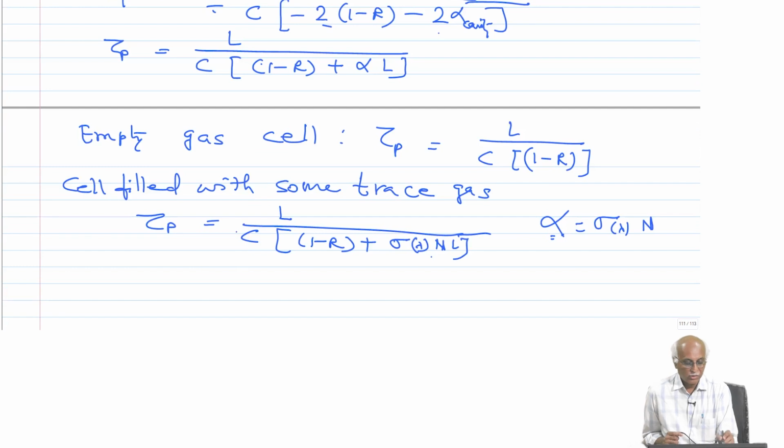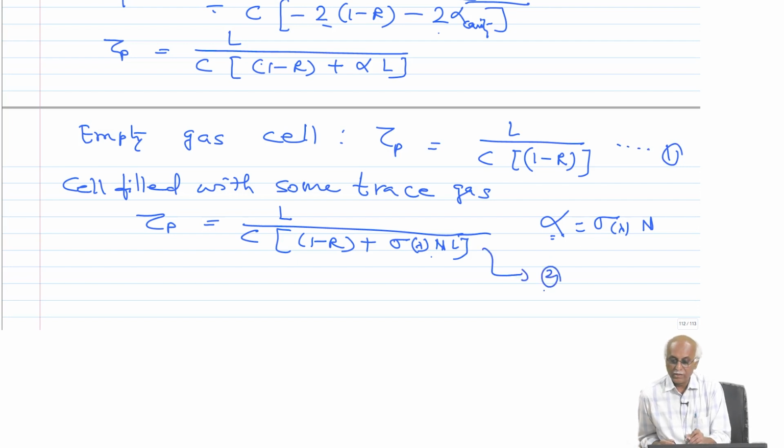So there are two equations, equation 1 for the empty cell, equation 2 for the cell filled with gas.